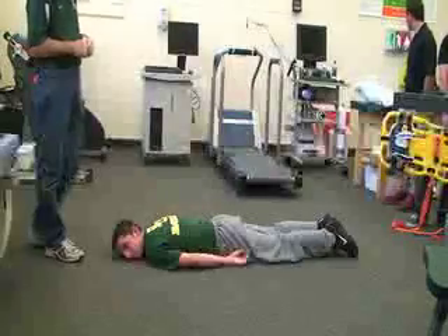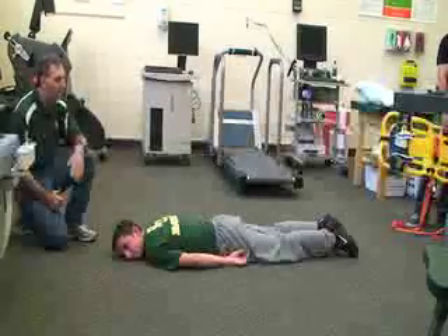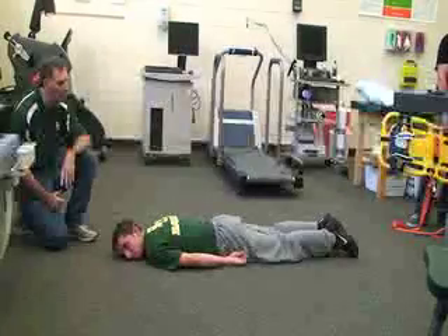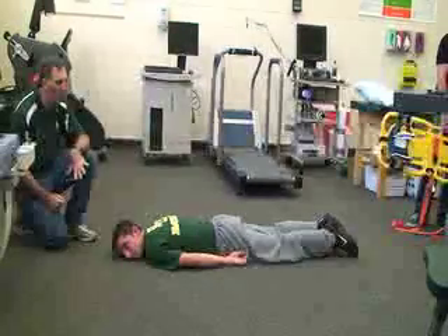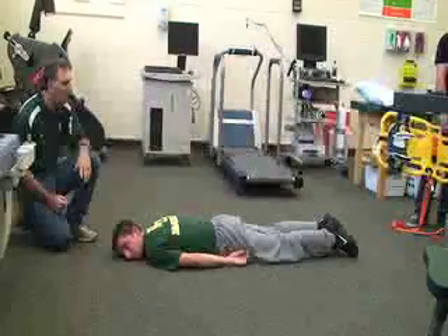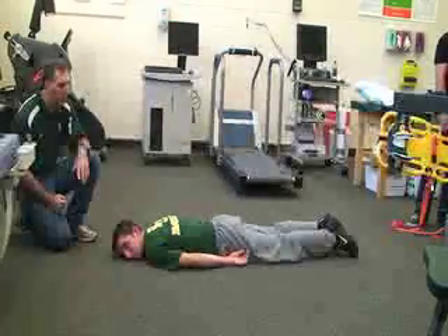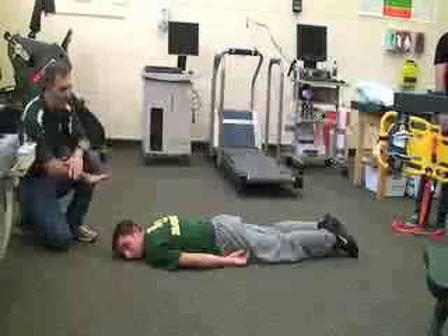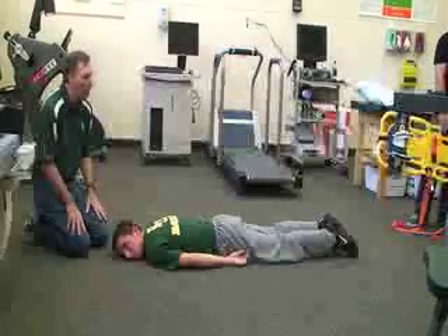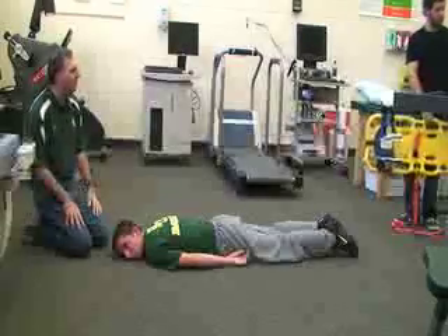Next we're going to be doing an immobilization for a victim who has a suspected spinal injury and we're going to need to backboard them. This will usually take at least one person at the head, which I'll call rescuer one, and then we'll have a second rescuer at the shoulders and then a third rescuer down at the feet. As I get onto the victim and do my assessment to determine whether or not he needs his spine board, I'll call my two rescuers out with the spine board.